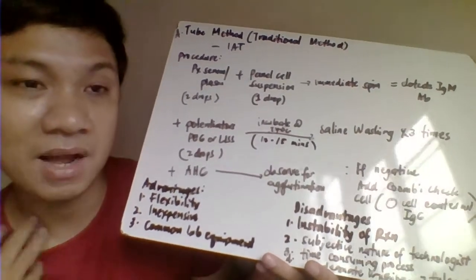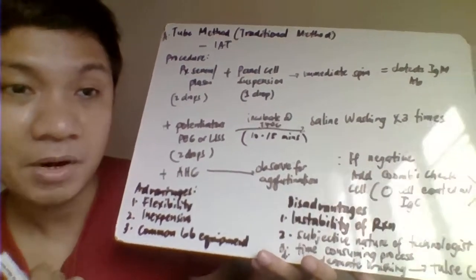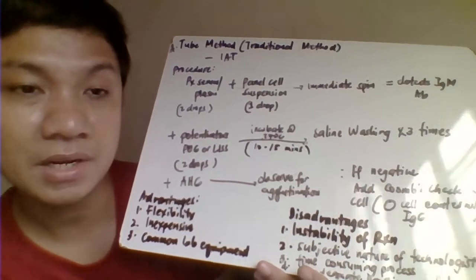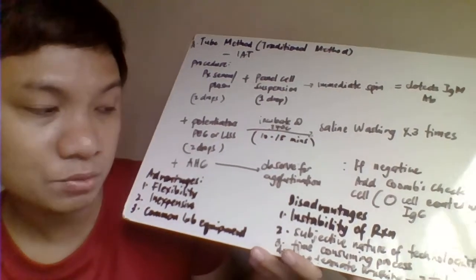Baka kasi minsan, di ba? So, kung hindi ka ganun ka-experienced, some reactions, sabihin mo na, ay, positive yan, pero actually hindi. Again, the interpretation of that as positive or negative would be highly dependent on the one doing the procedure because this one is a manual na procedure.